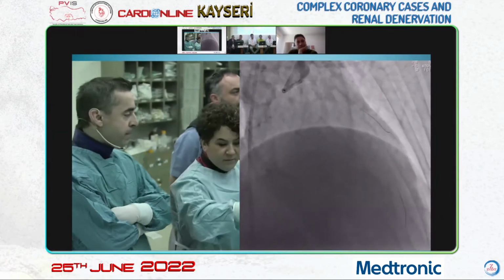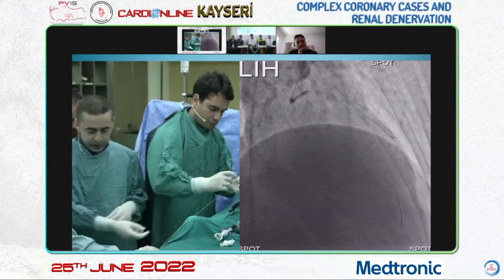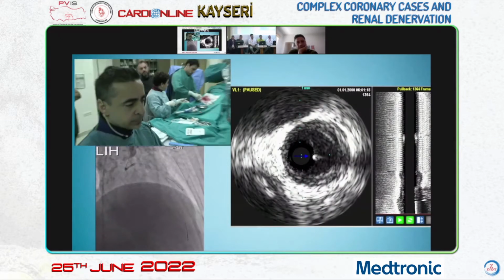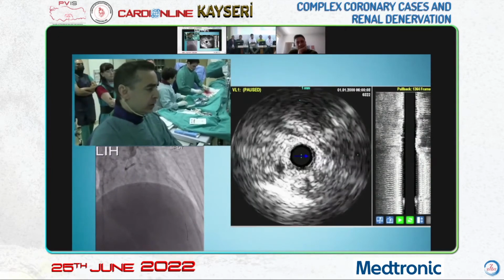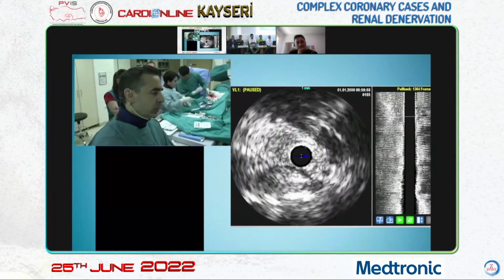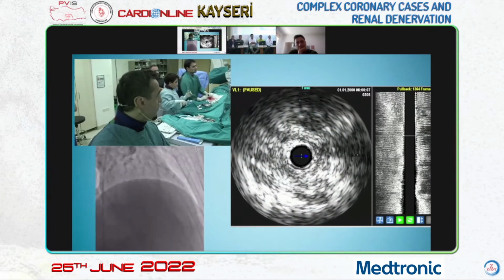The CT images are very bad. We cannot see the vessel. Let's delete this part. Can we see the IVUS? So to see it, we have the distal part. We cannot see the lumen. The catheter closes at the lumen.